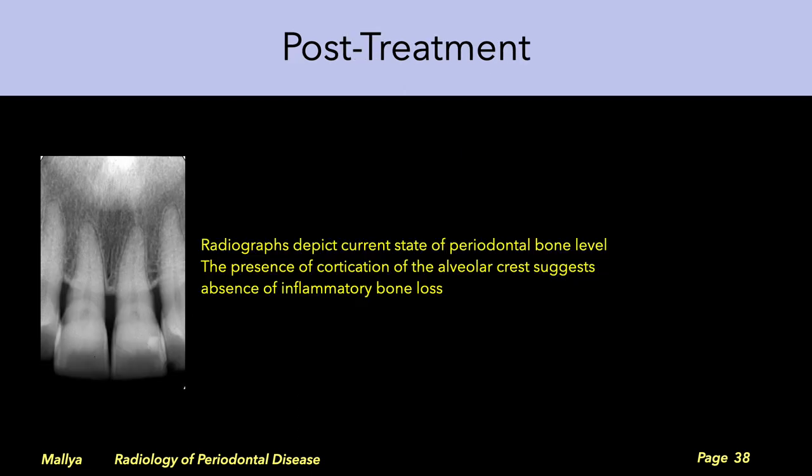As previously stated, radiographs depict both the current state of periodontal bone as well as the past inflammatory history. This radiograph demonstrates the periodontal bone in a patient with periodontitis that was successfully treated. Note how the alveolar crest is corticated, suggesting absence of current inflammatory bone loss.